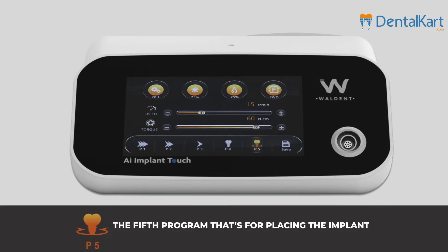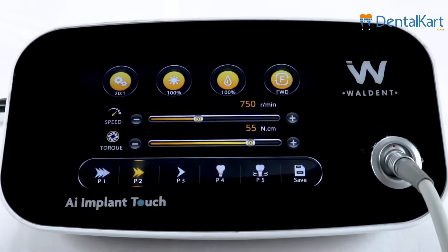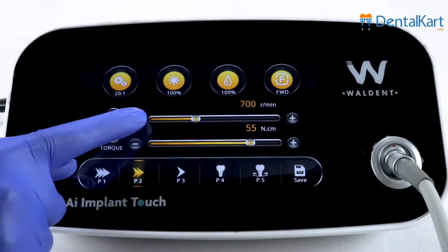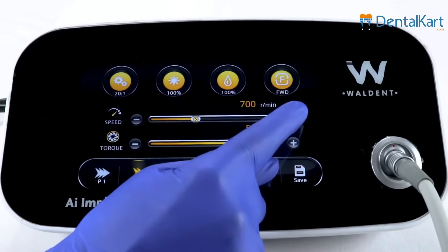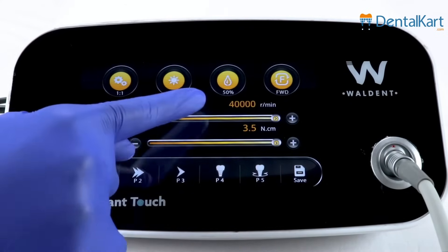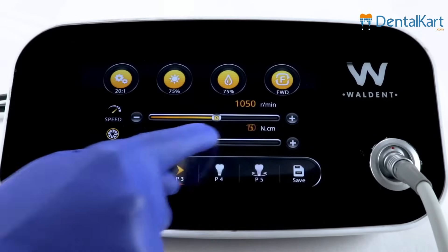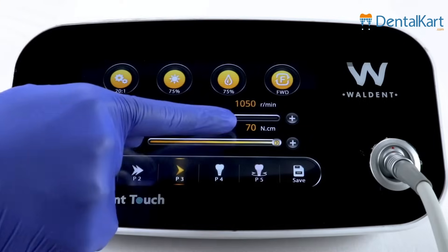Now look at the other icons on the display. We can adjust the speed by sliding — it's super smooth. I can also press the icon to decrease or increase the speed. The speed ranges from 5 RPM to 40,000 RPM. The torque can also be adjusted; the top range is from 5 NCM to 70 NCM.